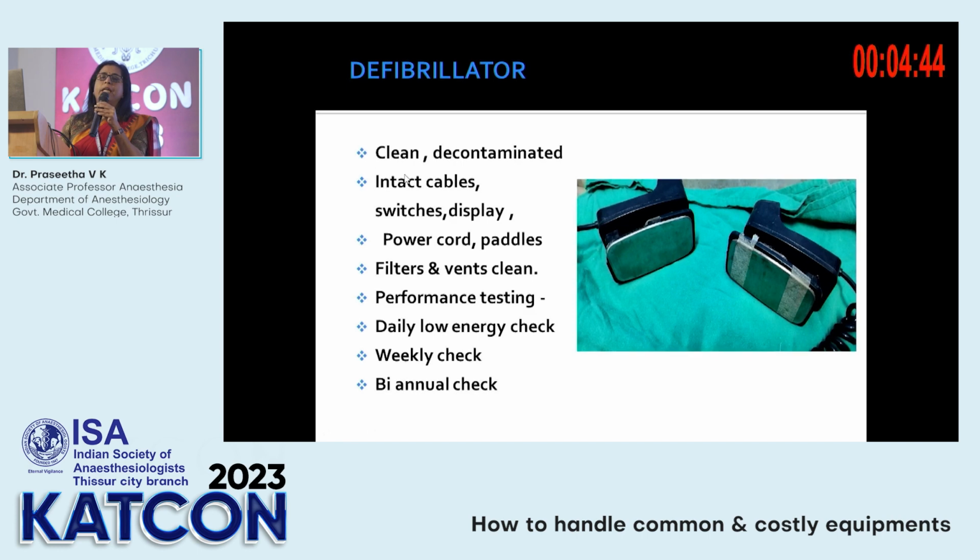And you check whether the cables of the defibrillator are intact, the switches, the power switches especially, and your selector switches for the energy levels, are they working? And how is the display of the monitor of the defibrillator? How is the power cord? Is it okay? Does it have any exposed wires? Paddles, how are the paddles? You can see on the right side, this may have happened when the paddles fell down during resuscitation. One of the paddles is fully damaged.